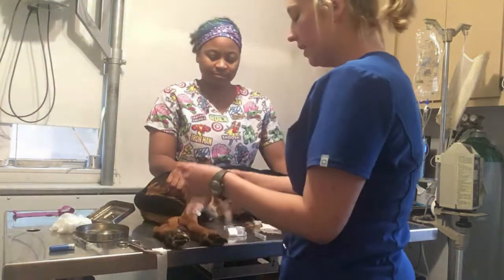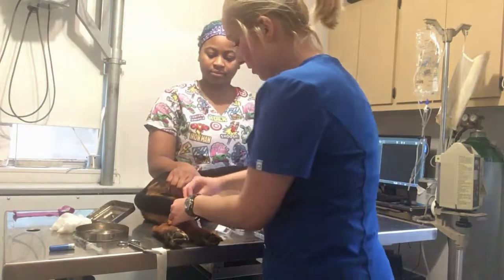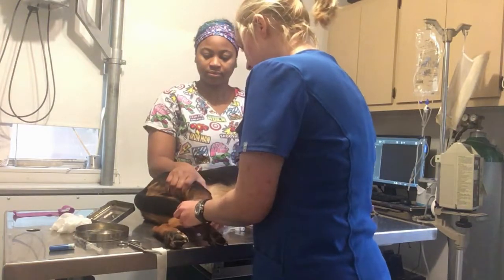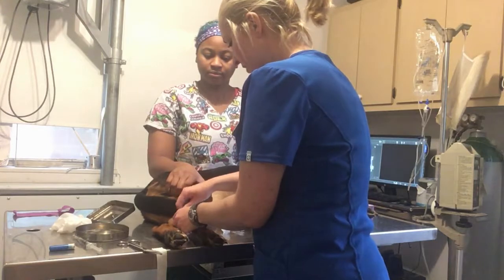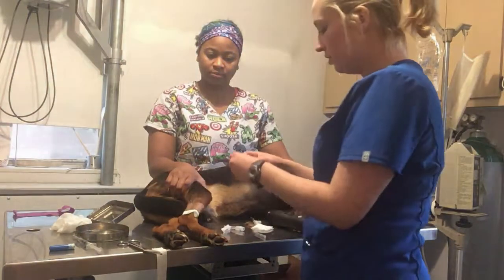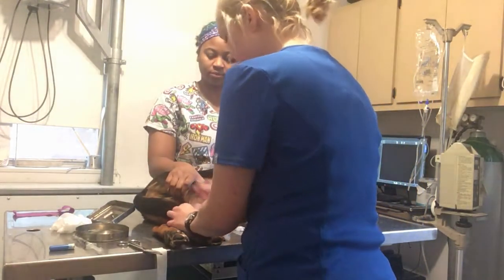And then you're going to go ahead and take your 1/2 inch tape. Tape your catheter down. Then you're going to take your 2-inch piece of gauze and put that underneath the plug.